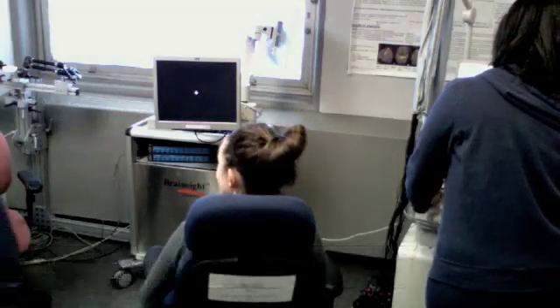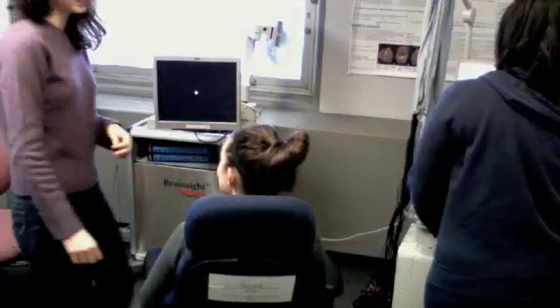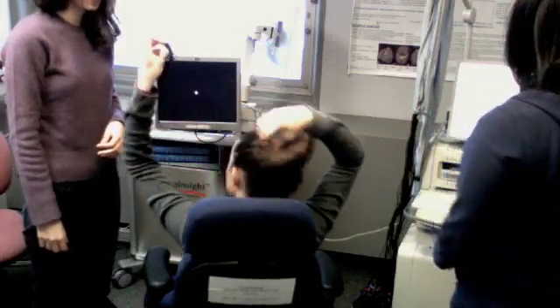So do I need to take my hair down? Yes. It's going to mess up my hair.